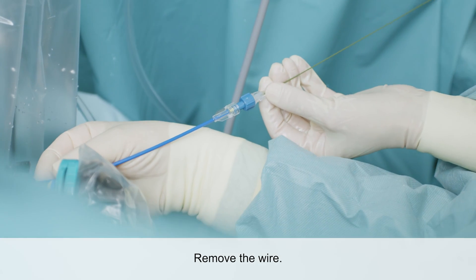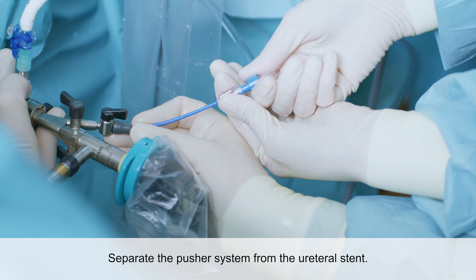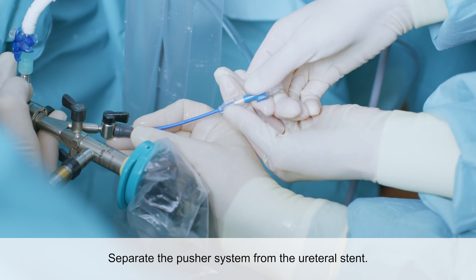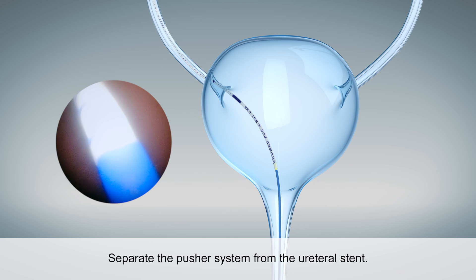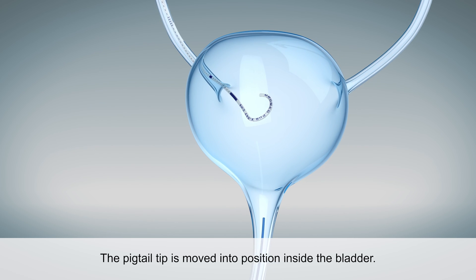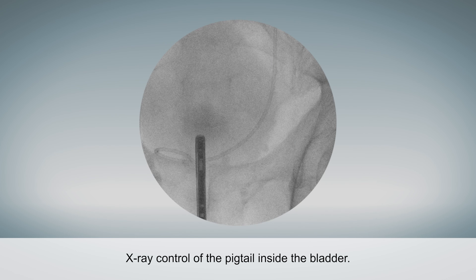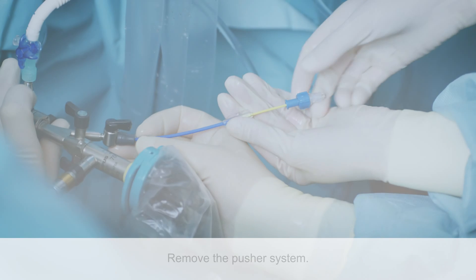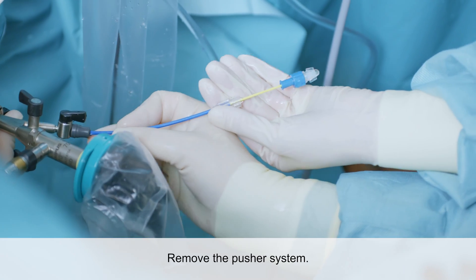The wire is then completely removed. The pusher system is turned counterclockwise to separate it from the stent, and the internal pusher is slightly retracted. Now the stent is detached from the pusher, and the pigtail can form inside the bladder. An X-ray is used to check the correct position of the pigtail inside the bladder.